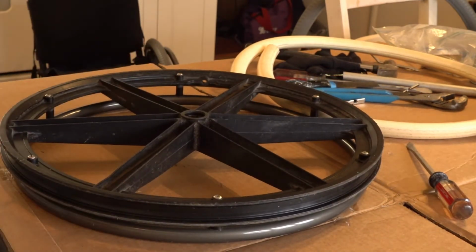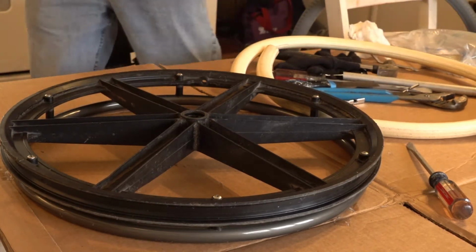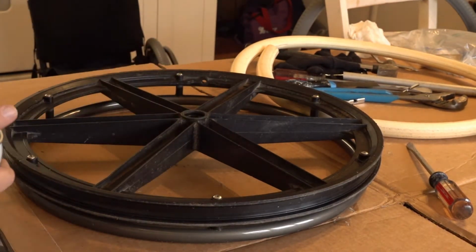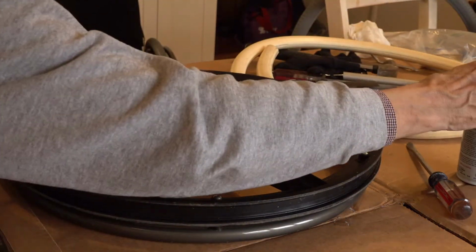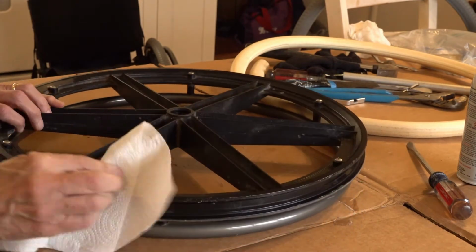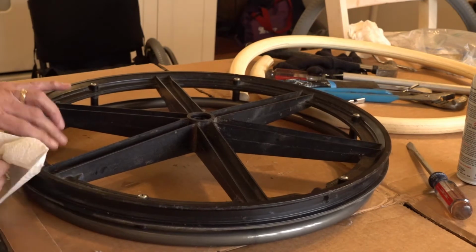As you've probably observed in other videos, in wheelchair tires it's sometimes helpful to put a little lubricant on it. I use a silicone spray to lubricate the rim here. Give it a little advantage here.